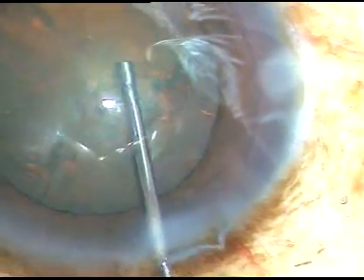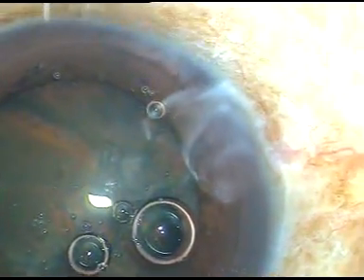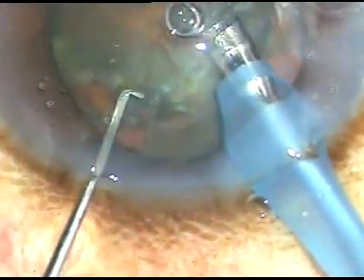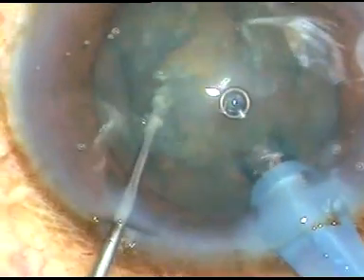Now this is hydrodissection. Hydrodissection is done very carefully so that I don't cause any rupture of the posterior lens capsule. Now the tip of the phaco probe is introduced into the anterior chamber. I am going bevel down and removing some peripheral cortical lens matter. This is removal of the air bubbles — I always remove the air bubbles because they disturb my visibility.